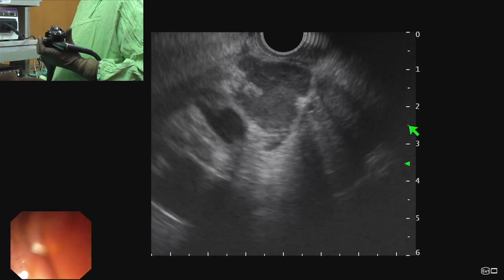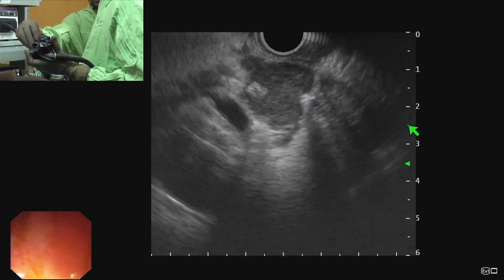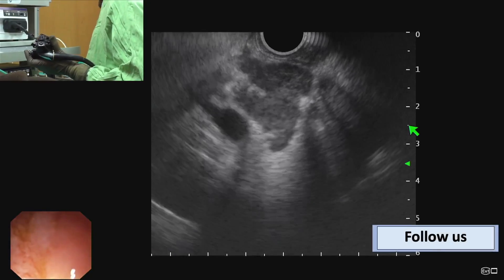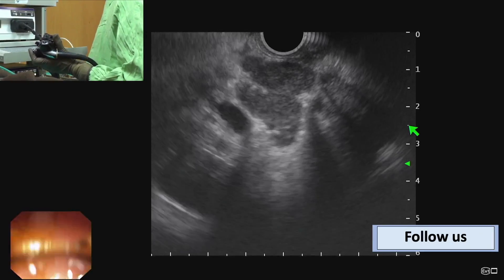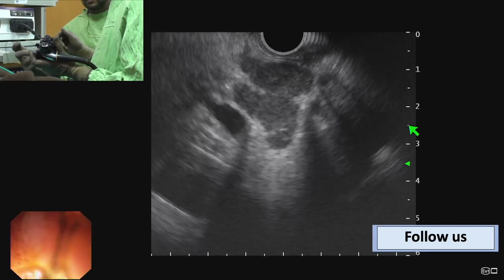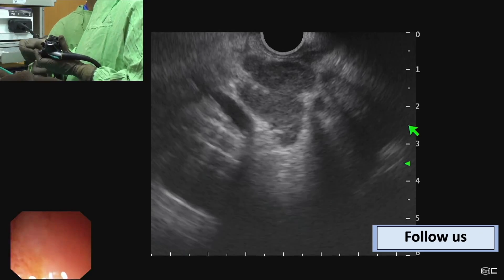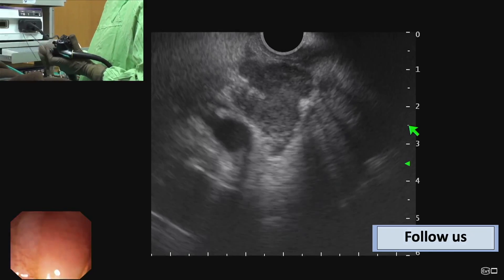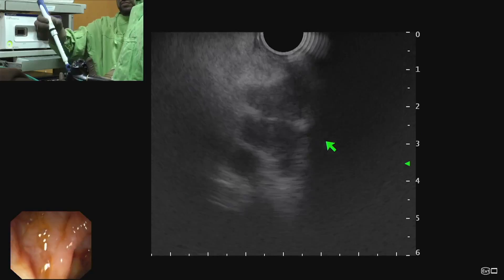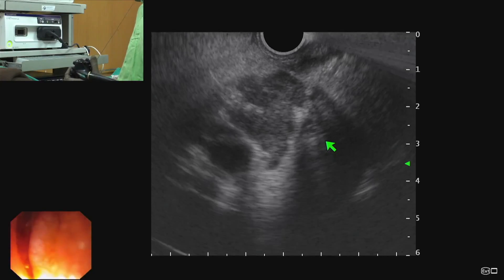When we saw from the stomach, this node was below the portal vein, but when we came to the duodenum this node is seen between the probe and the portal vein. So this node can be easily sampled from the first part of the duodenum.